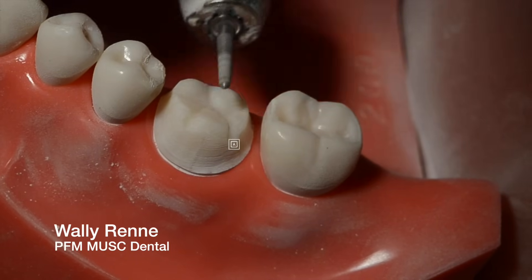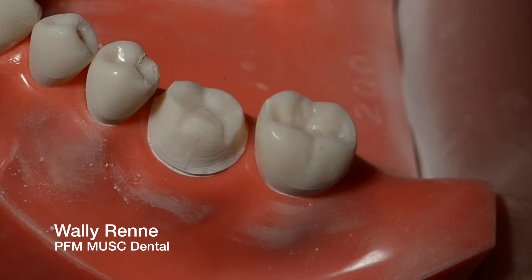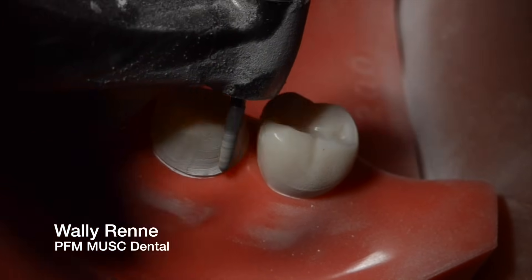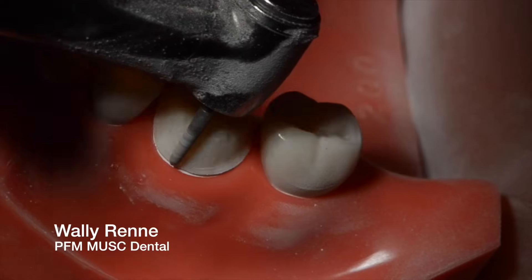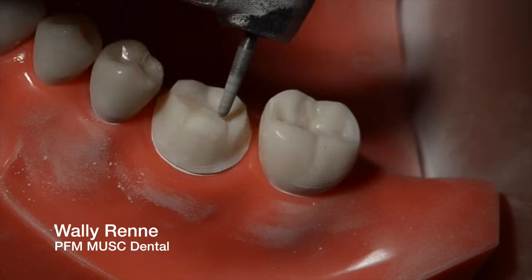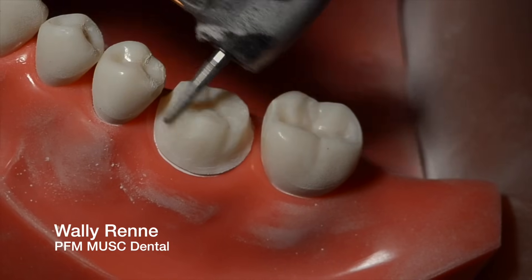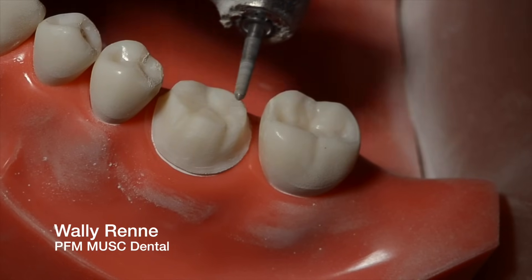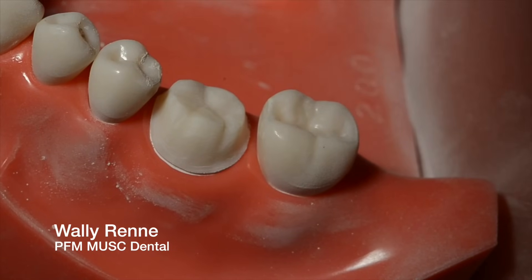Fine-tuning my bevel. The lingual should have just a slight bevel — the non-functional cusp bevel is really subtle. And then I'm just making sure that I have smooth finish lines now. Slowed the speed down to maybe like a 10 rather than a 20. Buccal groove — I like that. No sharp corners. Rounding that marginal ridge, accentuating a little bit of last-minute anatomy. So this is a good rough prep.